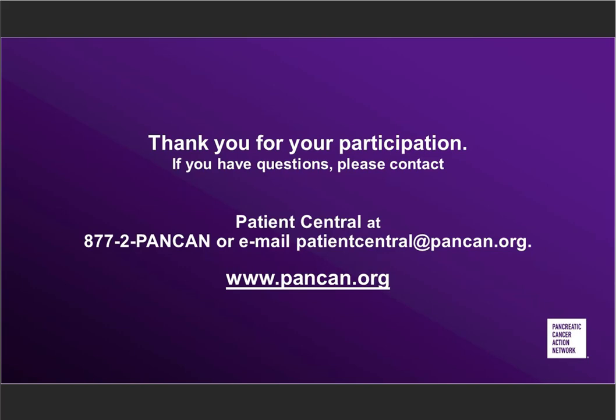You have to say, what kind of machines do you have? Do you have what's called image guidance? Do you have a way of looking at my tumor in real time? Or are you going to use fiducial markers, which are little gold seeds that you could track it? Or how many of these cases have you done? What kind of experience do you have? I think it is getting more complicated.